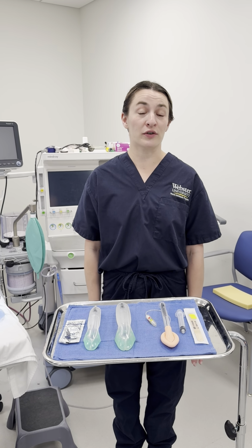So to get prepared, before we even start to talk to the patient, do a thorough airway assessment. We're going to make sure our safety things are in place. And then we're going to want to lube the back of the LMA. We're going to put the lube on these devices on the back here. We want to avoid putting lube around the sealing part of the airway, because that will hinder your seal so that you won't get good adequate volumes. So you would avoid putting lube down here. You would only put lube up here, on the back. So now that we've got our LMA prepped and ready, that's pretty much all the prep we need to do to get ready for the patient, okay?